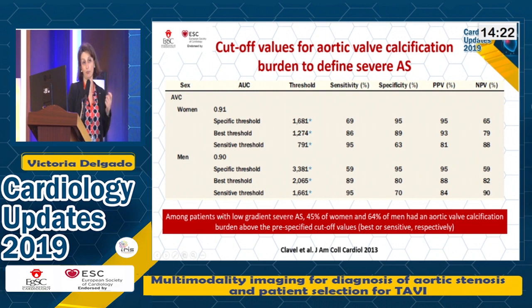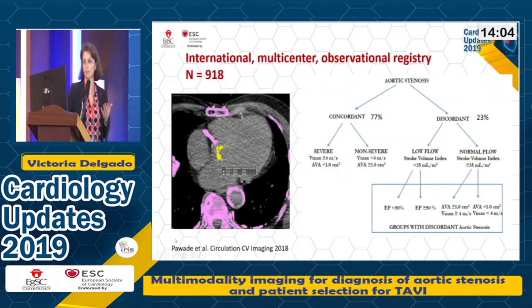And among the patients with low gradient severe aortic stenosis, like the patient that we showed, 45% of the women and 64% of the men had an aortic valve calcification burden above that pre-specified cutoff value, which means that this technique could help us to differentiate those patients.